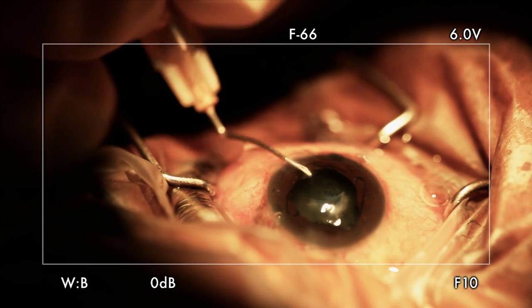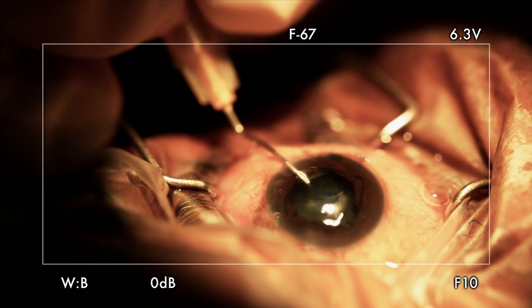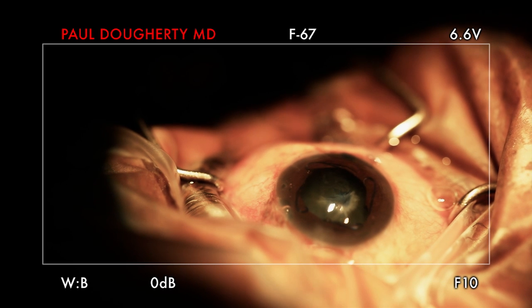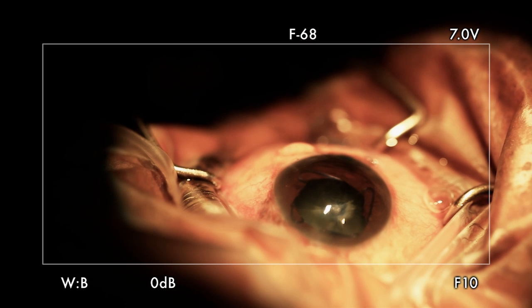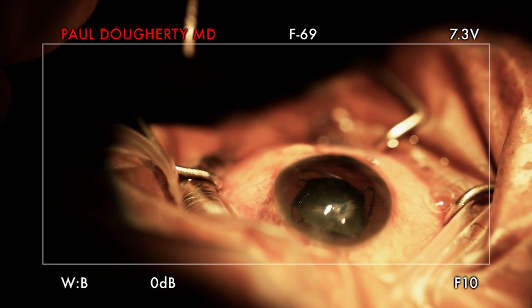This capsule's really very fibrotic. The viscoelastic. How do you see with the scope? Is it good? What's the magnification on that? There's no magnification, really — it's a high-definition signal, so it's 1080 by 1920.